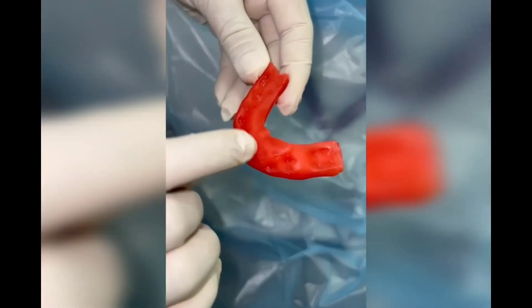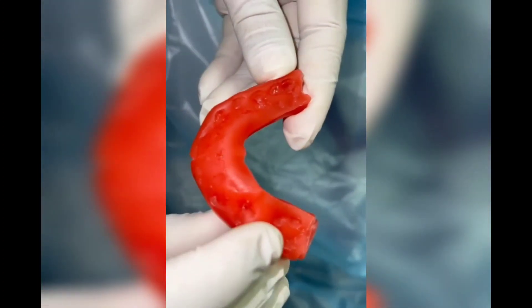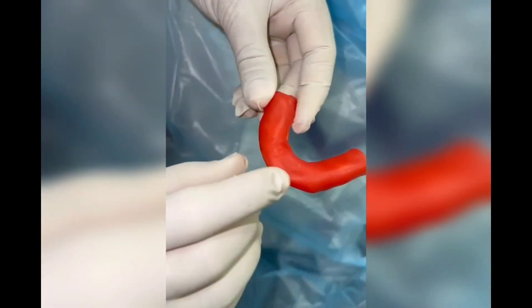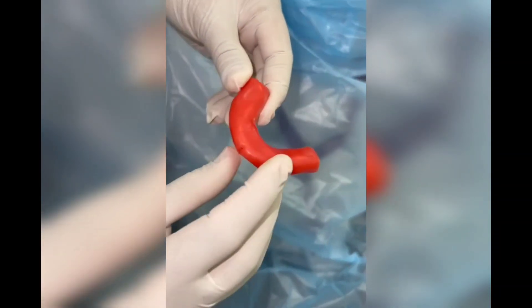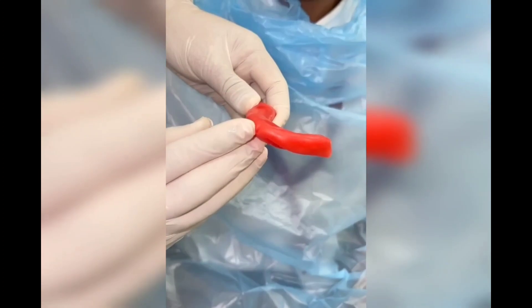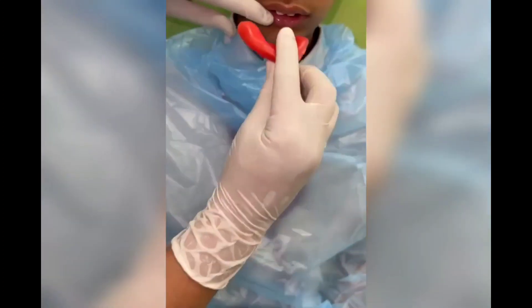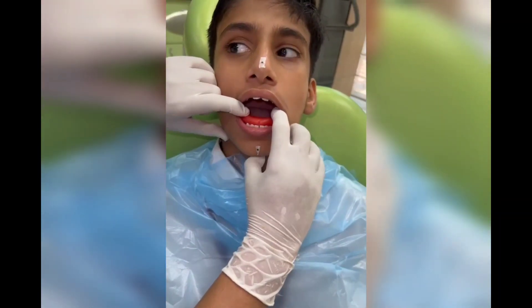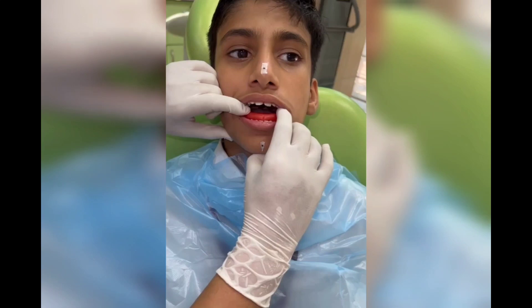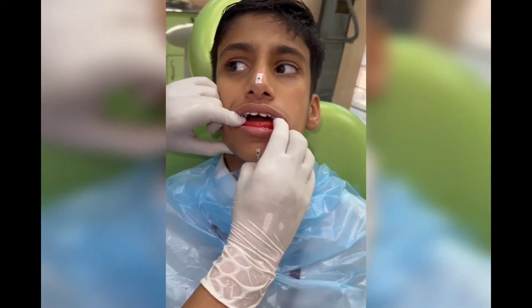The indentation of the lower teeth is already on the wax sheet. Now we have heated the upper surface and we will be recording the bite. Make sure to match the midline with the mark based on the bite, then gradually guide the patient to the desired position.